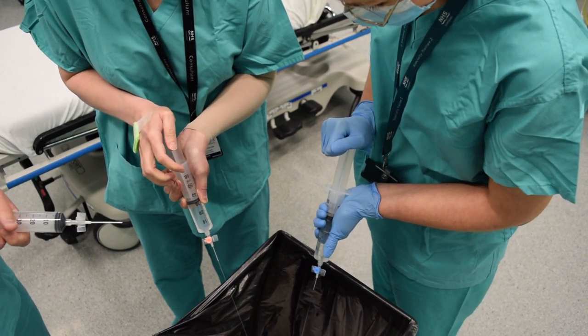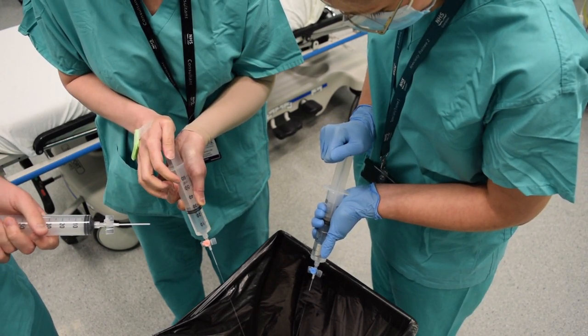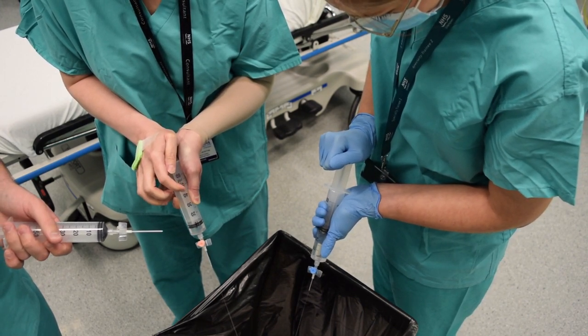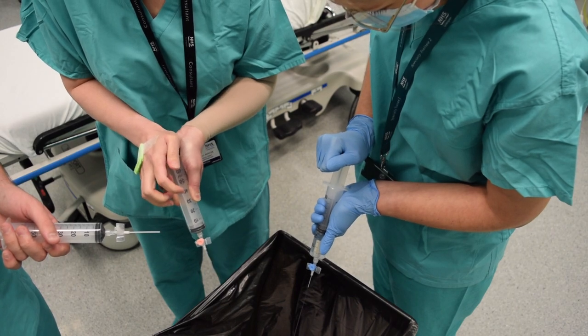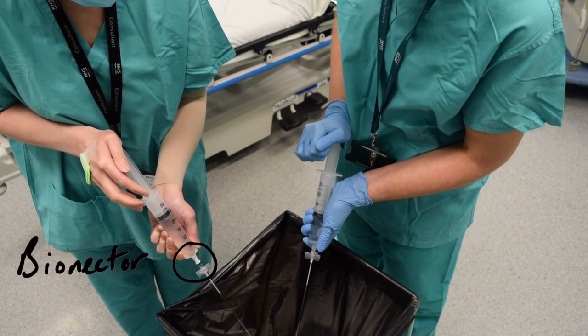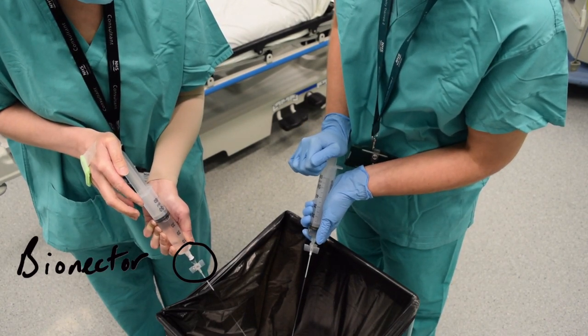A blue cannula can deliver 42 mls per minute, a pink cannula 67 mls per minute, and a grey cannula 236 mls per minute — so it makes a really big difference. Important to note: if you add any connectors like bionectors or Y connectors, you will restrict the flow rate even through a large grey cannula down to that of a pink cannula.